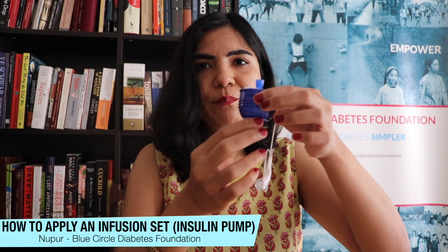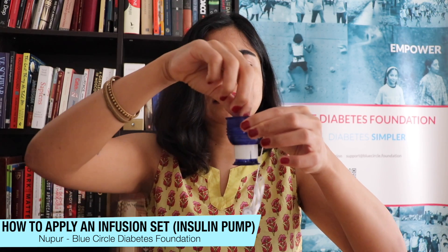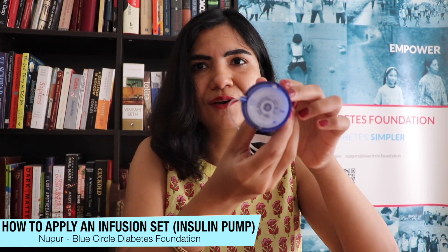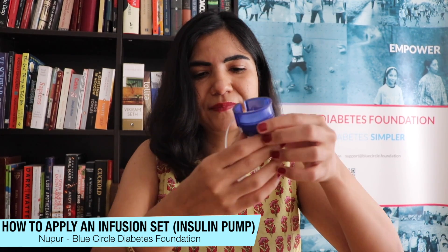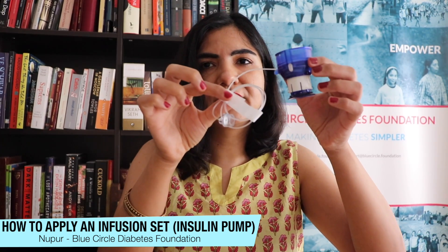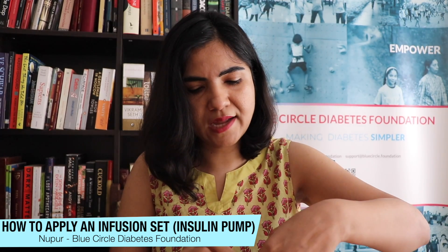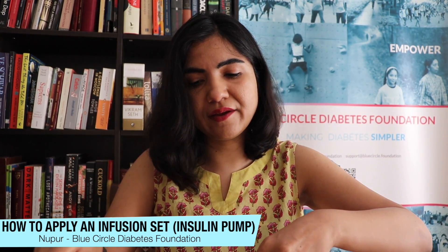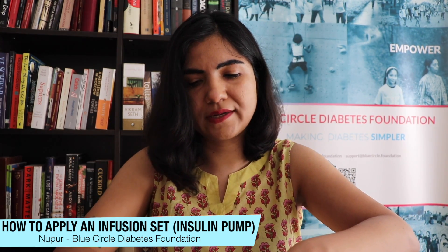You pull it in like this and take off the covering — now you can see the needle that will go into my body. There's a little paper clip here that you need to remove. Make sure the area where you apply your patch is clean and wiped down with alcohol or spirit.